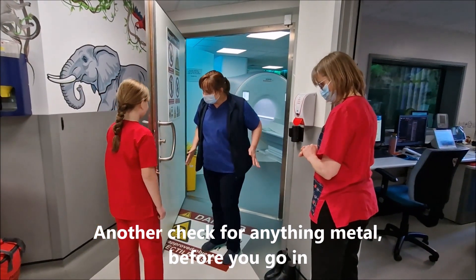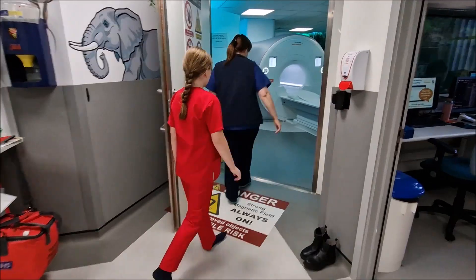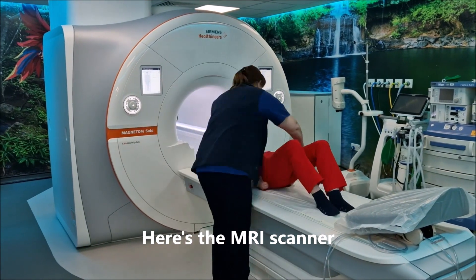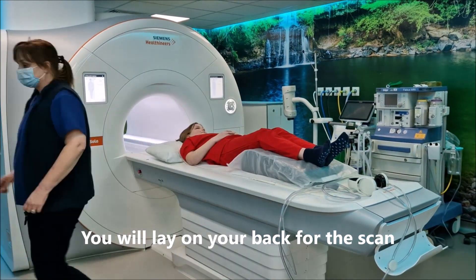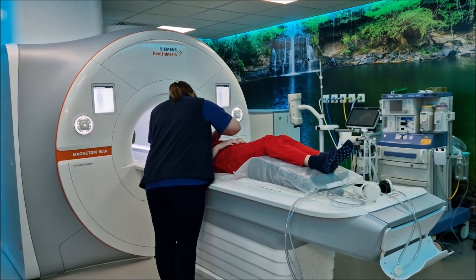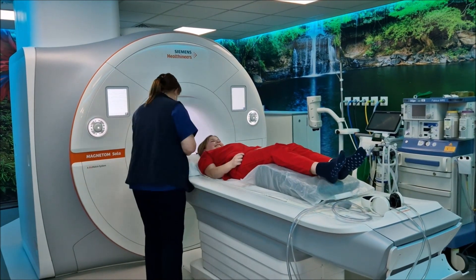Before you go in, there's just a quick check again. Once you're all metal-free, we'll ask you to lie down on the scanner and we'll make sure that you're really nice and comfortable. Next we put the table up so we can look after our backs, and then we put some ECG stickers onto your chest so we can monitor your heartbeat.